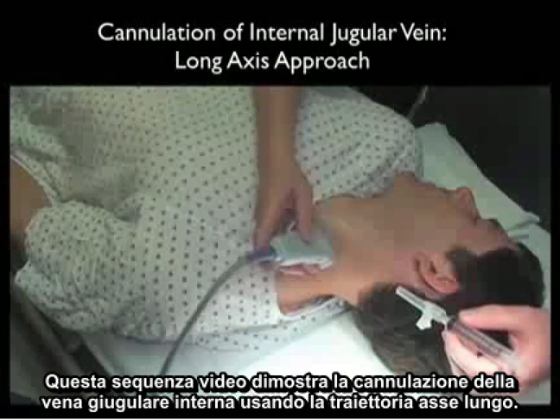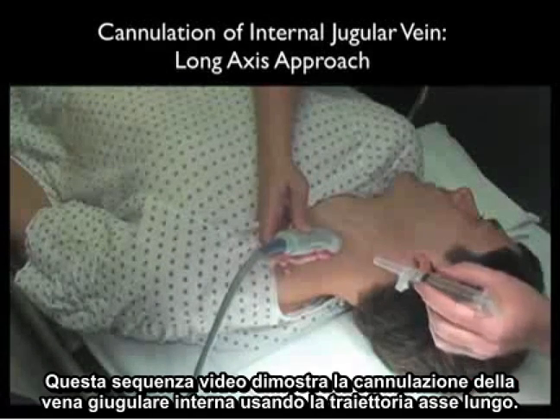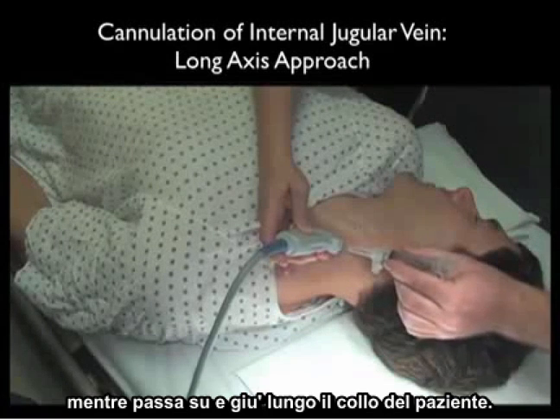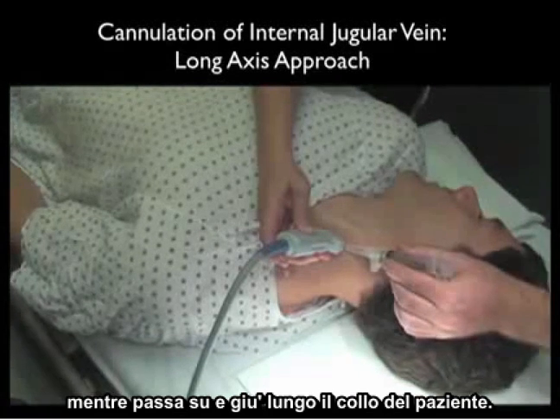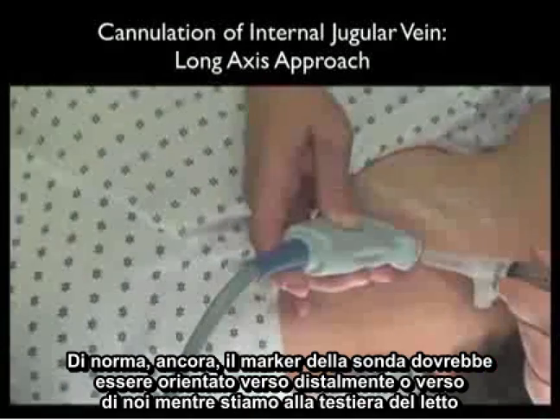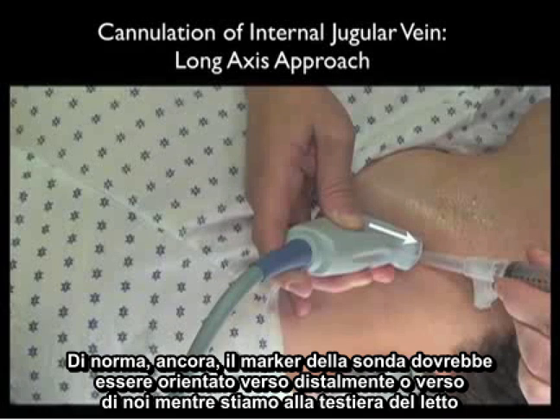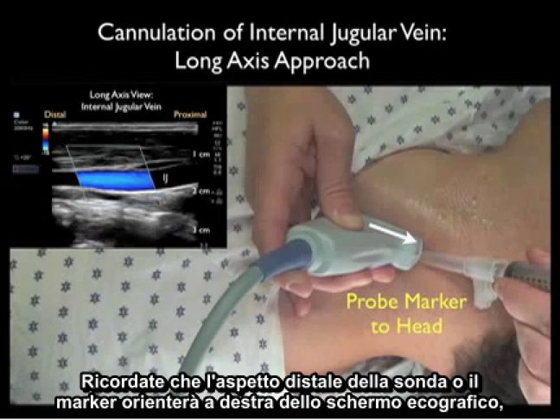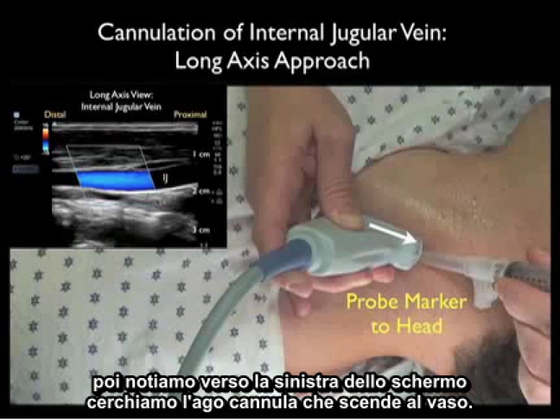This video sequence shows cannulation of the internal jugular vein using the long axis trajectory. Notice we swivel the probe into the long axis orientation along the course of the internal jugular vein as it runs up and down the patient's neck. By convention, the probe marker should be oriented distally or towards us as we stand at the head of the bed. Notice the cannulating needle will come in at a 45-degree angle under the distal aspect of the probe, and the distal aspect or marker will orient towards the left of the ultrasound screen — we can then look towards the left of the screen for the cannulating needle coming down to the vessel.